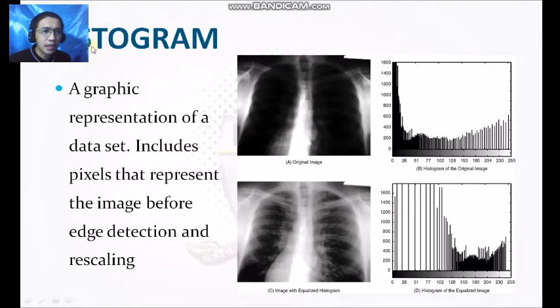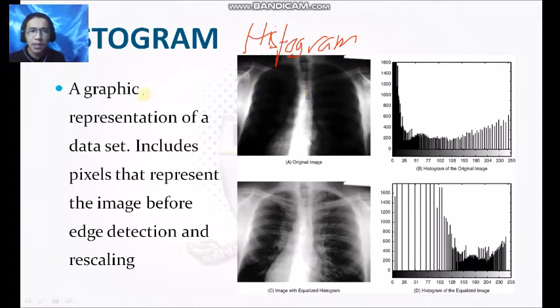That is histogram, no? Histogram. Okay, histogram. So histogram is a graphic representation of a data set.